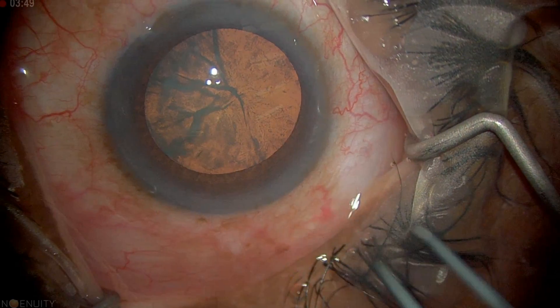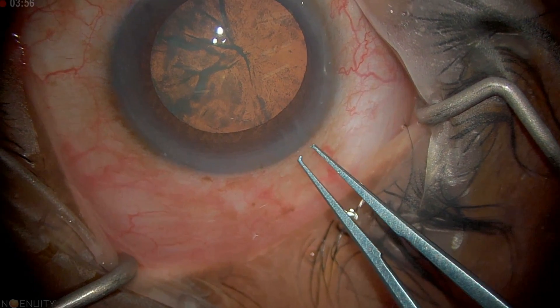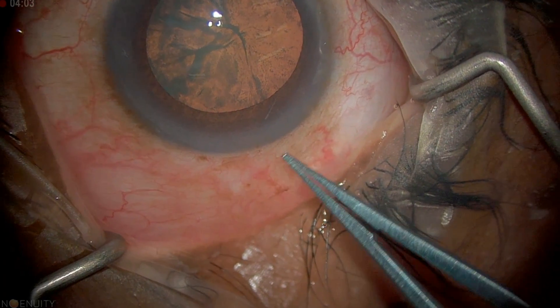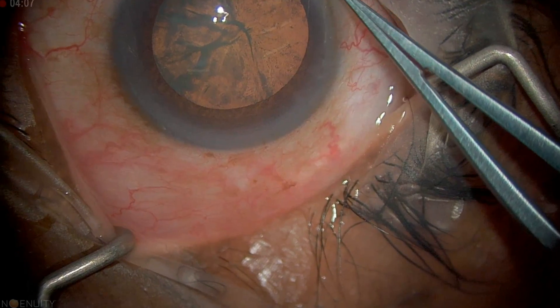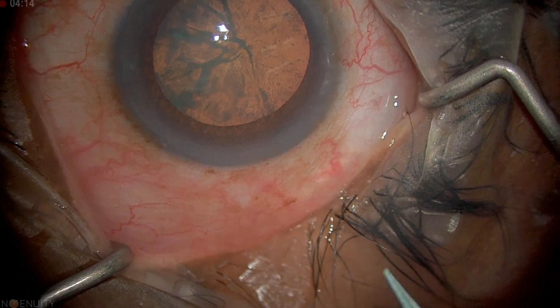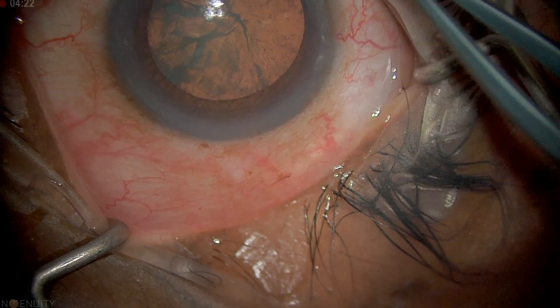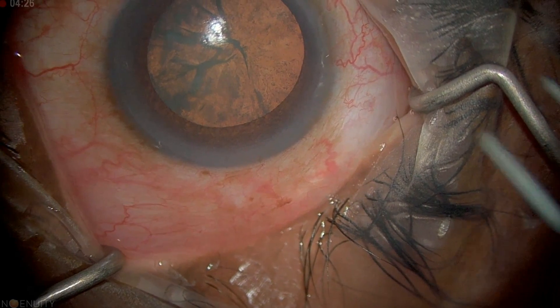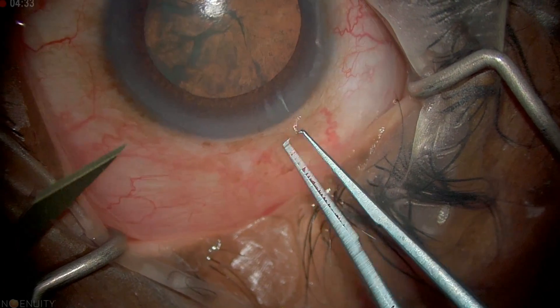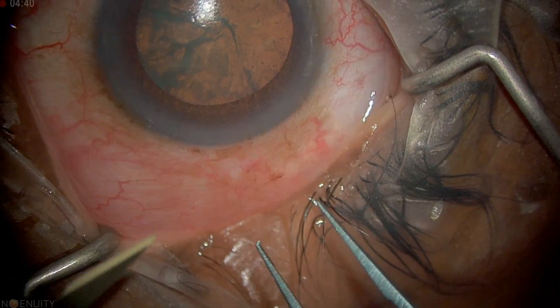I like to use a 0.12 to start my wound and I'm going to be making a temporal or maybe just a little bit super-temporal wound. I really like the temporal approach for several reasons. This is the farthest point from the visual axis, so if you go superiorly you are closer to the visual axis. Also, going temporally means my glaucoma colleagues love me because I spare all the superior conjunctiva for them, should the patient need glaucoma surgery in the future. With clear cornea you still spare the conjunctiva, but here you have no problems at all for them to make their flaps and corneal tunnels.